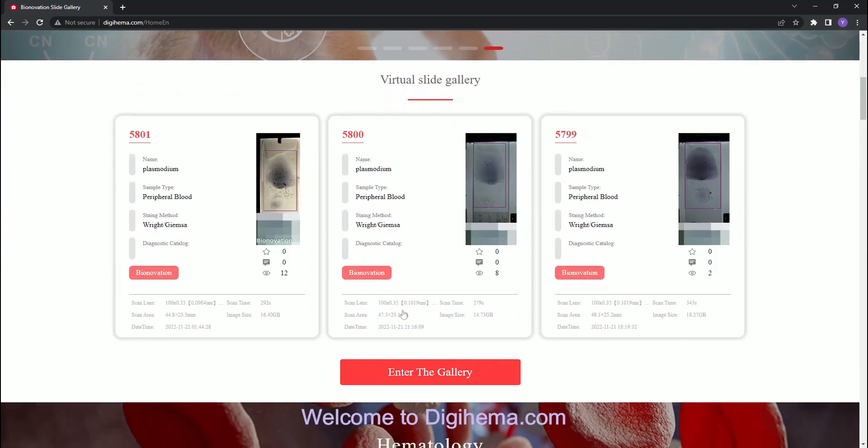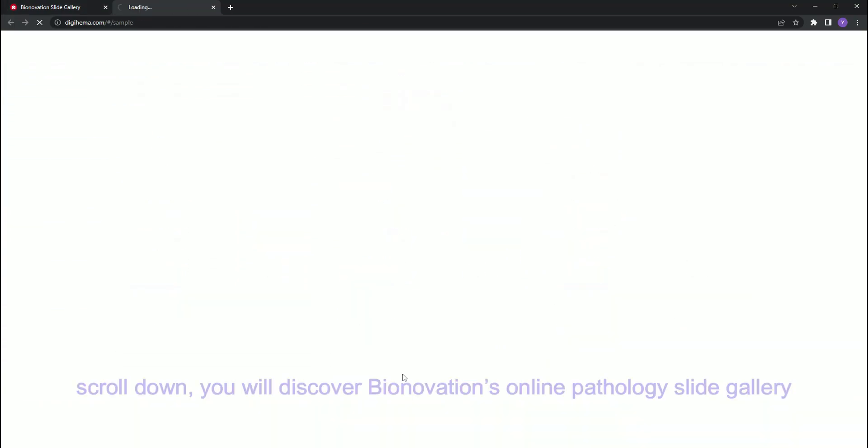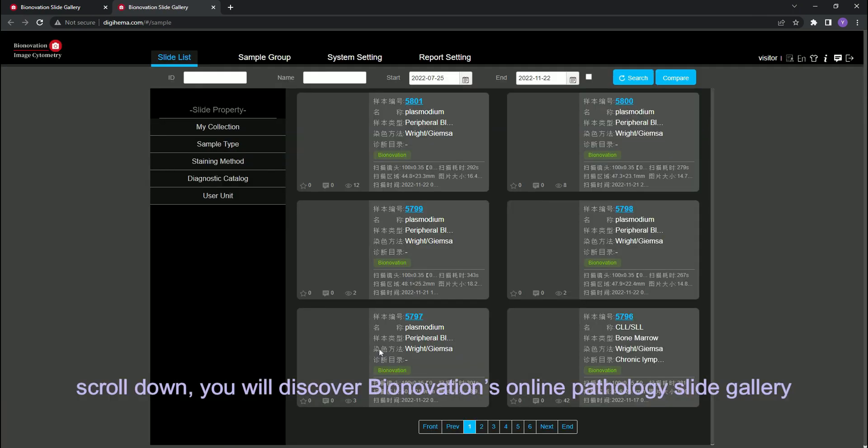Welcome to digihema.com. Scroll down, you will discover Bionovation's online pathology slide gallery.